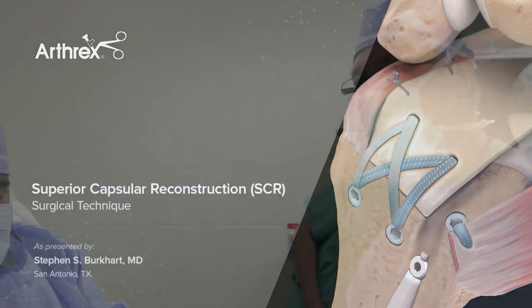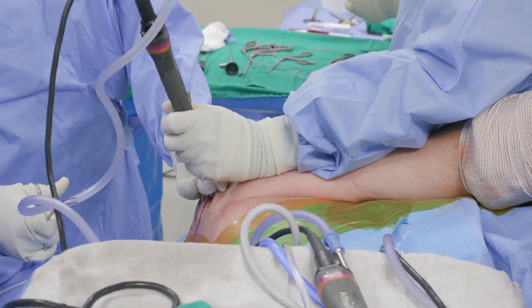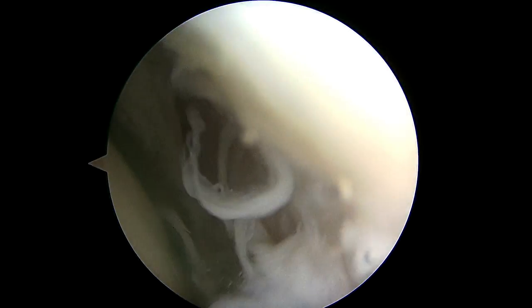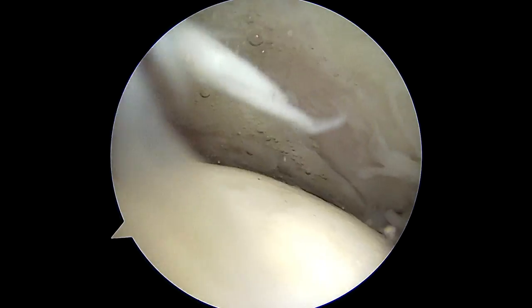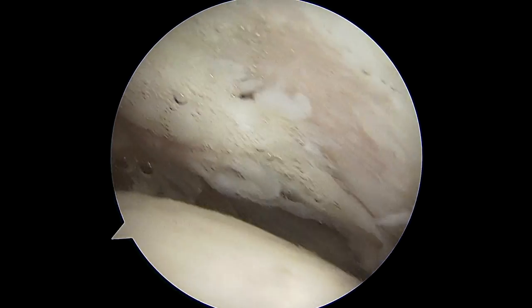This patient is a 56-year-old man who has been having severe left shoulder pain on a chronic basis with limited range of motion only up to about 90 degrees. About a year and a half earlier we did a superior capsule reconstruction on his opposite right side, which has done very well. He's very happy with it and now he's come back to have the same procedure done on his left side.